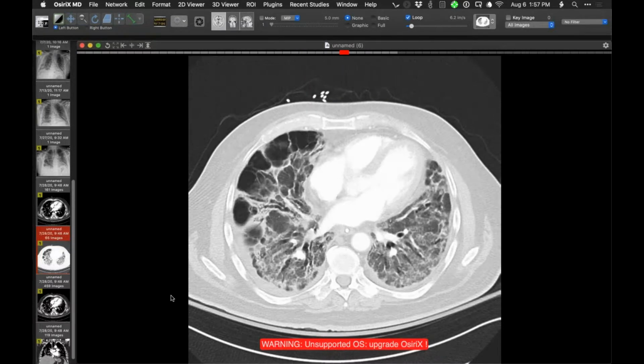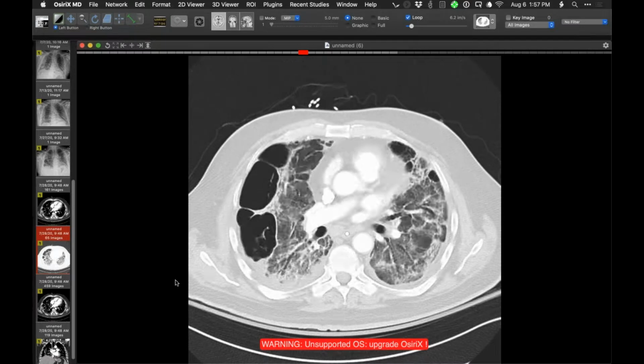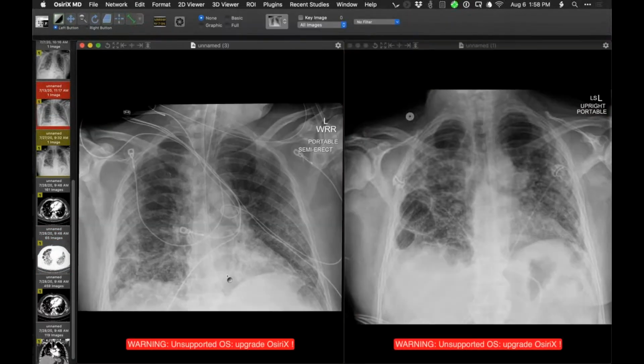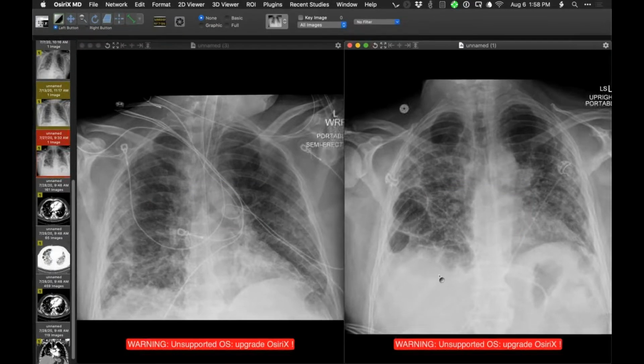I've seen that in other kinds of ARDS. And the question is how much of that is the ventilator, puffing up some spaces in stiff lungs, and how much of it is lung destruction from the inflammatory process. But I think the baseline is that it's related to the bad ARDS and ventilator dependence.